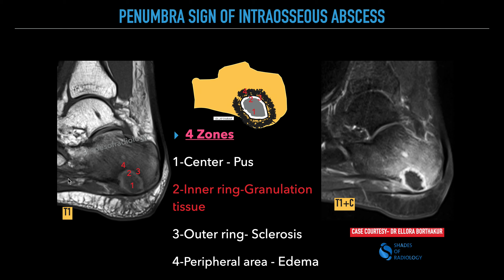On this T1 weighted image, you can see a well-defined lesion. Zone 1 is in the center, followed by zone 2, zone 3, and zone 4. The center — zone 1 — is nothing but pus. Zone 2 is the inner ring which is T1 hyperintense, and on post-contrast you can see a thick rind of enhancement representing granulation tissue. Zone 3 is the outer ring representing sclerosis or a fibrotic reaction. Zone 4 is the extensive edema surrounding the lesion.